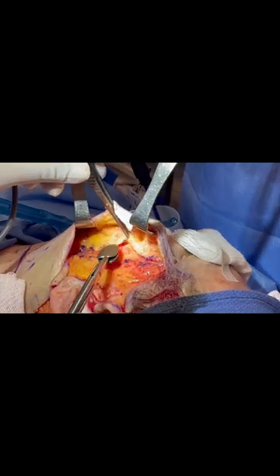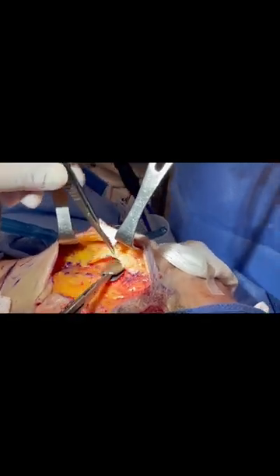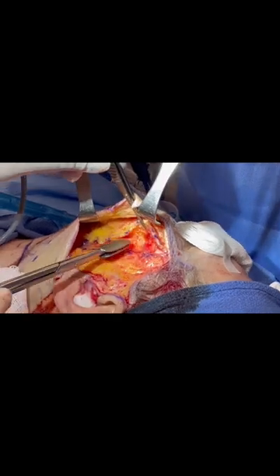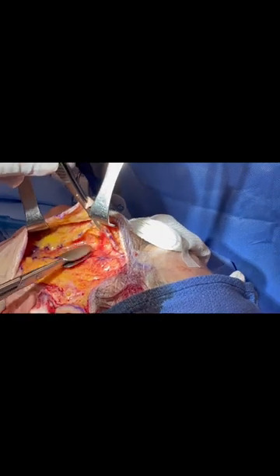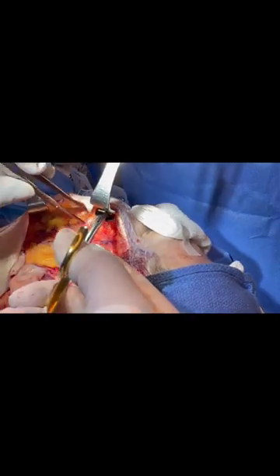Superiorly I have the zygomaticus major muscle that I'm following inferiorly, and above that I have the orbicularis oculi that I am above, entering medially towards the midface.